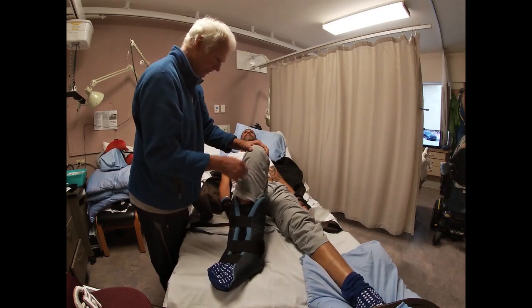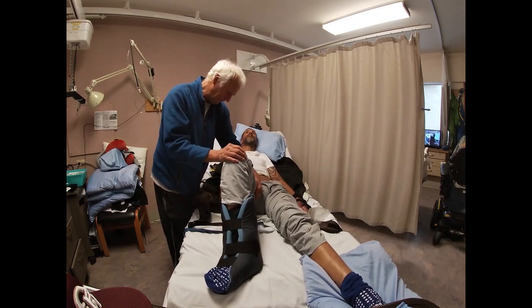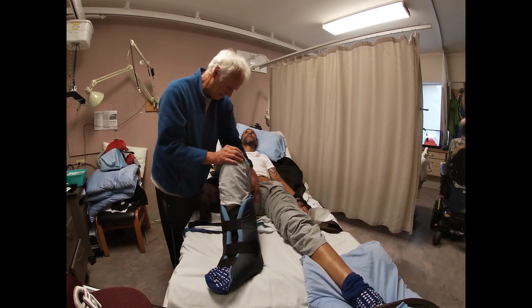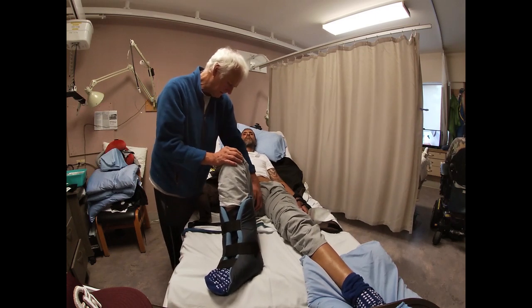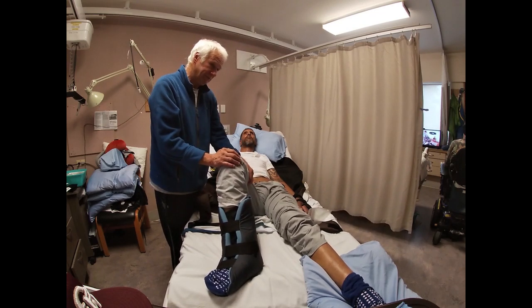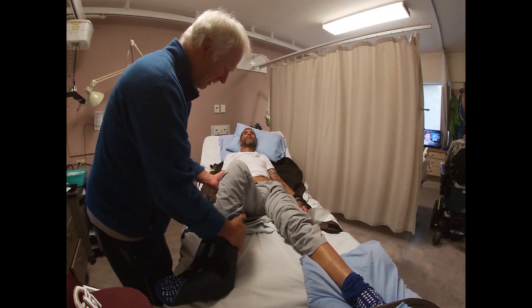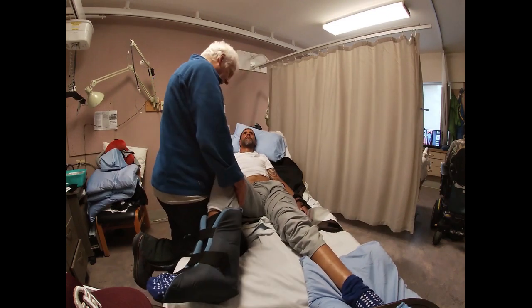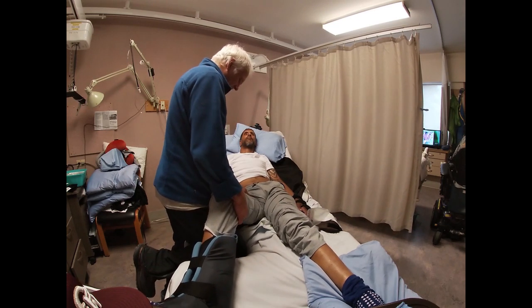Alright, let's move this one here. So here the spasm is not as bad as on the left side. It never is. The left side causes a lot more problems. It feels just as tight in the quads, but the left side is what triggers off the spasms. So my thoughts are, if this person is strapped in every day for an hour, just even an hour, then his brain is going to realize that his body isn't as in spasm through the hips anymore and through the lower back, and hopefully the spasms will become less and less, where he'll be able to actually gain some movement back.